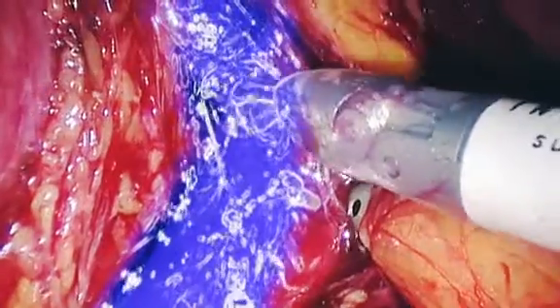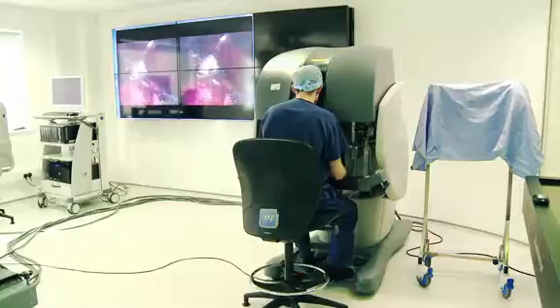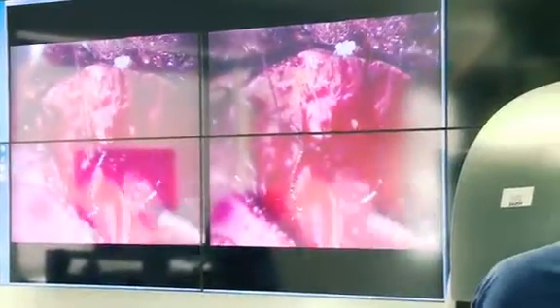It's there to enhance the safety of the surgery and particularly thinking about excising the tumour completely, not leaving what we call a positive margin, i.e. a bit of cancer behind that may need you to go back at a later stage and take out the whole kidney. So the end result of this research, apart from assisting the surgeon of course, is making sure that the patient has a better outcome, both in terms of cancer cure, but also in terms of safety and enhanced recovery from the surgery.